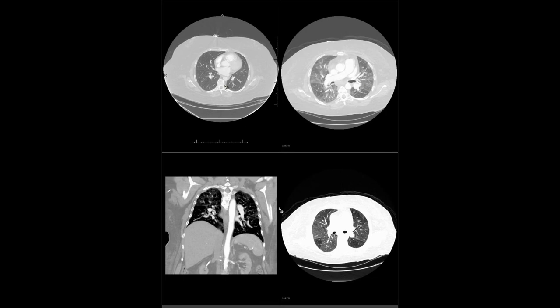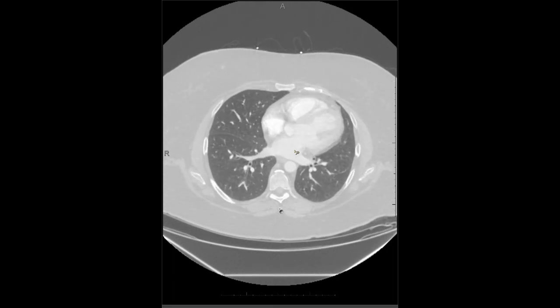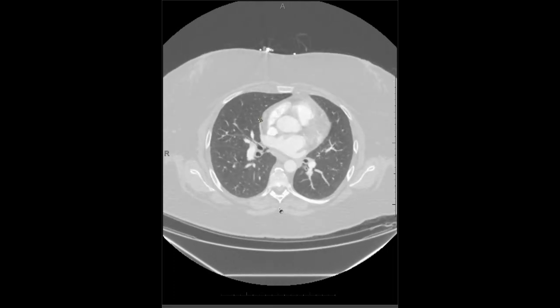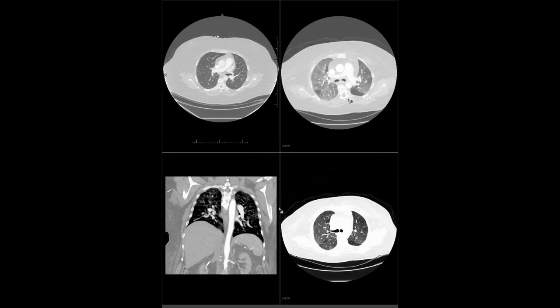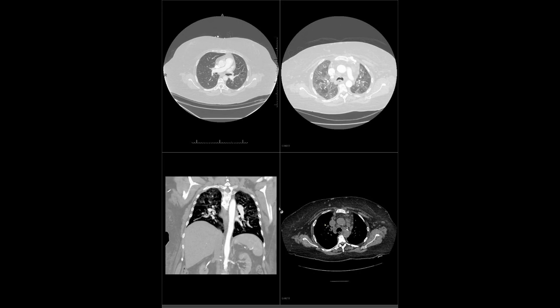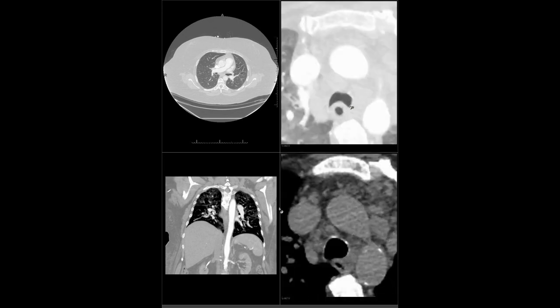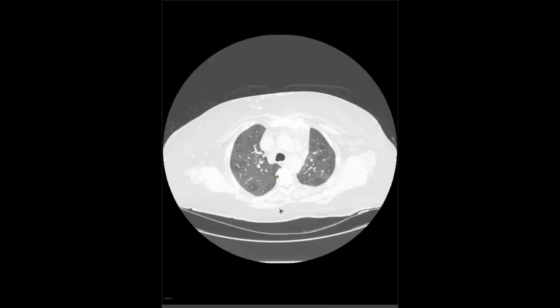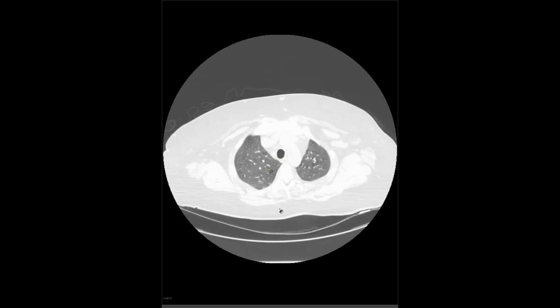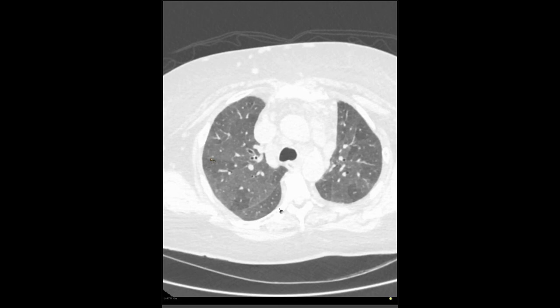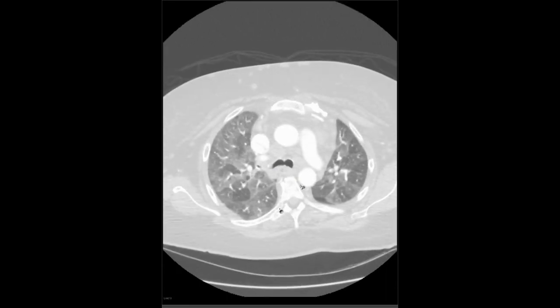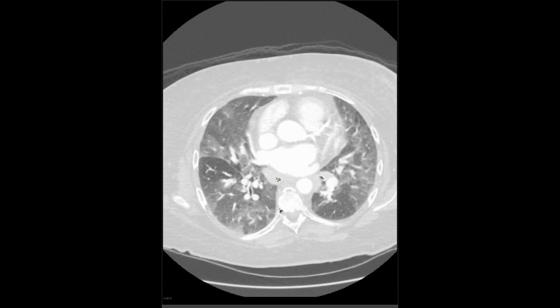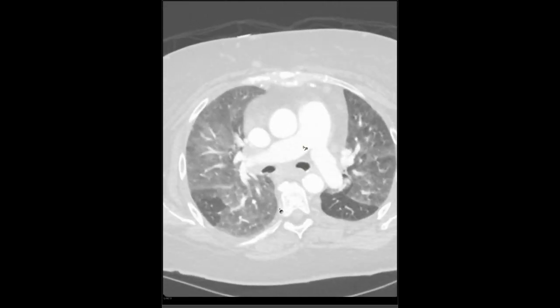This is a middle-aged woman with pulmonary hypertension. An exam from eight years ago shows relatively normal lungs, maybe some airway thickening. They were worried about dissection, so they did both a non-con and an arterial phase. The non-con was done in the inspiratory phase. You can see there's a mosaic perfusion pattern with geographic areas of relative lucency. The CTA was done in the expiratory phase, which really accentuates the findings but doesn't change the distribution. A nice case of mosaic perfusion from pulmonary hypertension - you can see the PA is large.